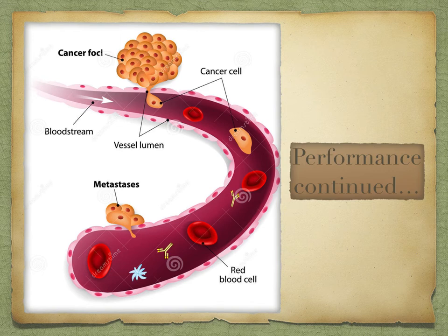The three-phase bone scan is used to detect bone infection. Pictures of the bones will be taken soon after the tracer is in the patient's body, and then 3-4 hours later once again, as it would have gotten into the bones by that time. If one wants to look at the metastatic bone disease, they have to take pictures of the bones 3-4 hours after the tracer has been put into the body.